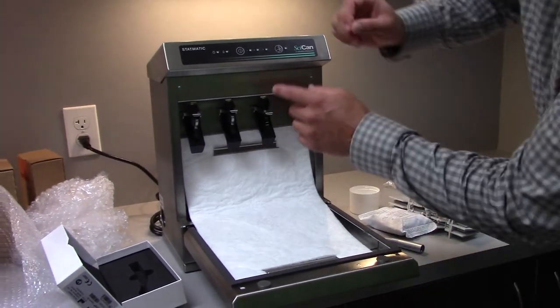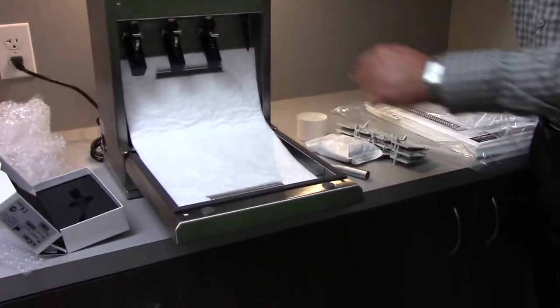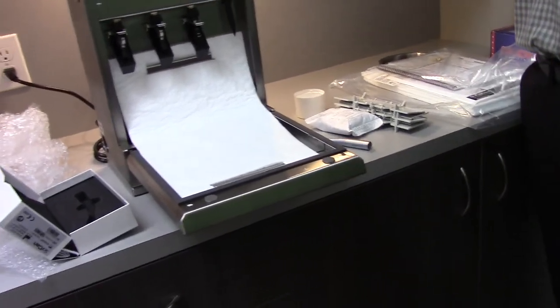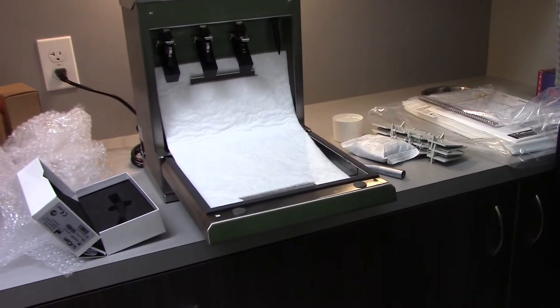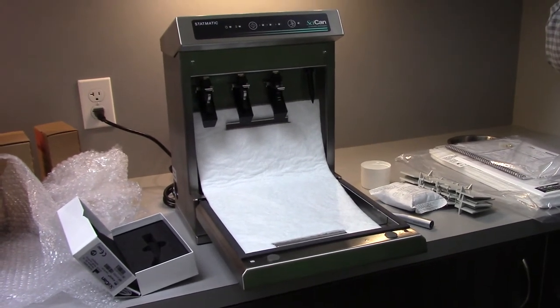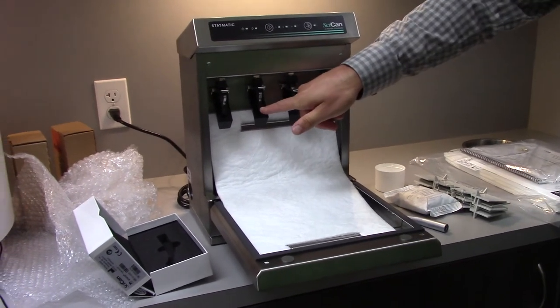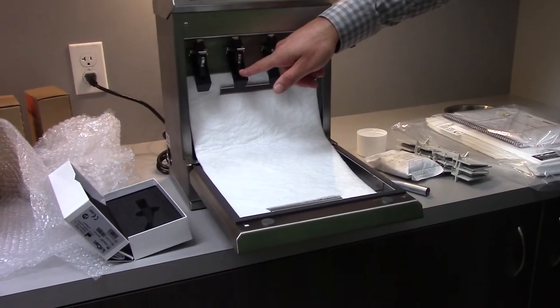I'll just show you real quick, and I'll probably just send it to you. For low speed, you're connecting just the motor or the contra-angle attachment? Just the attachment, the part that slips onto the E-style. Right, so that's what this is. Is that pretty universal? It is. Do you guys have slow speeds?